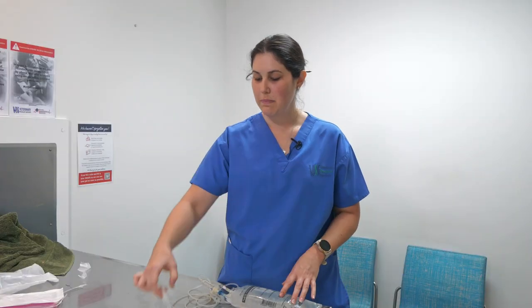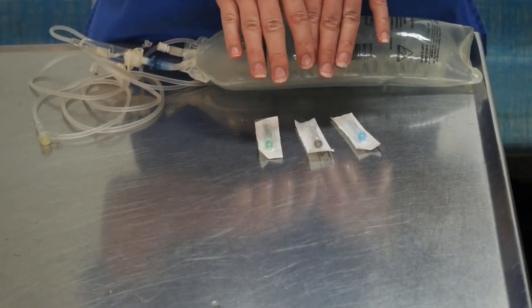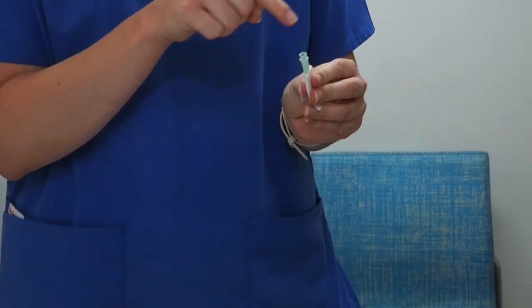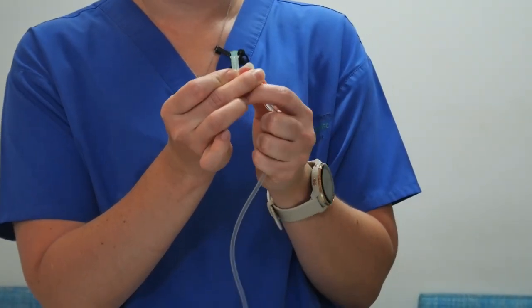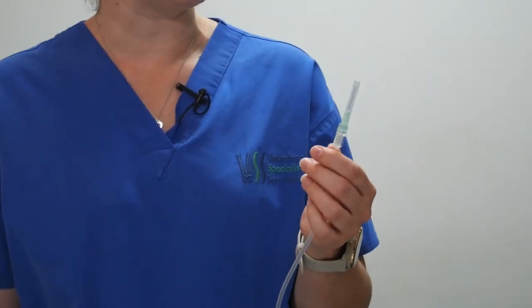Now that we've got that set, you may or may not receive one of these smaller giving sets with your pack. This can be used for a little bit more length and may not always be required — we just attach it to the end of this one and flush the line through as well. In your pack, your vet will have chosen the appropriate sized needle for your pet. Take your needle, open the packaging, remembering to keep the attachment nice and clean and sterile. Then take the end of the fluids, keeping it clean, twist on, and you're ready to go.